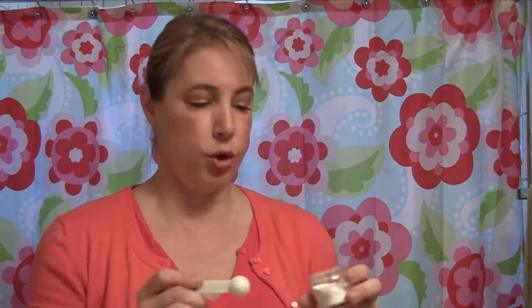I only use it when I'm going through a period where maybe I feel like a sinus infection coming on. There's, again, more gunk up there than normal. And I'm going to use half again as much. So if I used a rounded half teaspoon for the salt, I'm going to use half of that, so actually a 1/4 teaspoon, just a little tiny bit in here, and I'm going to put that in my Neti Pot.